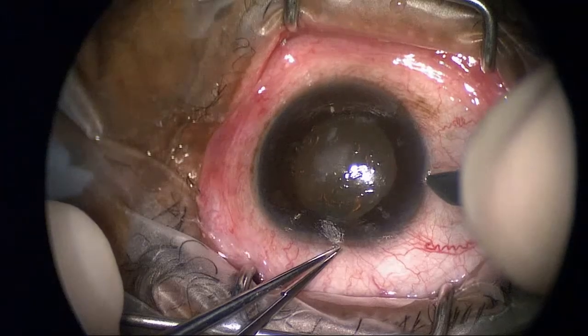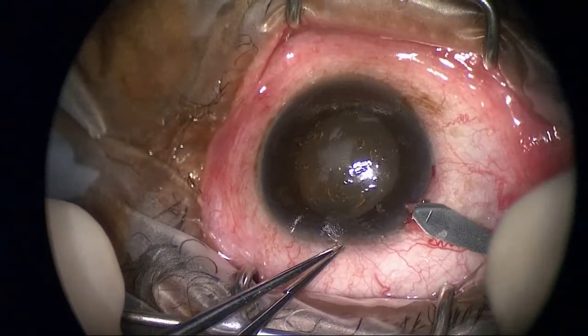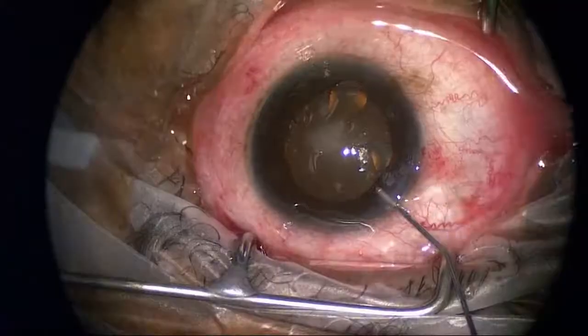Today I'm hoping to demonstrate a triple procedure consisting of a DSEK corneal transplant, cataract removal, and IOL insertion.